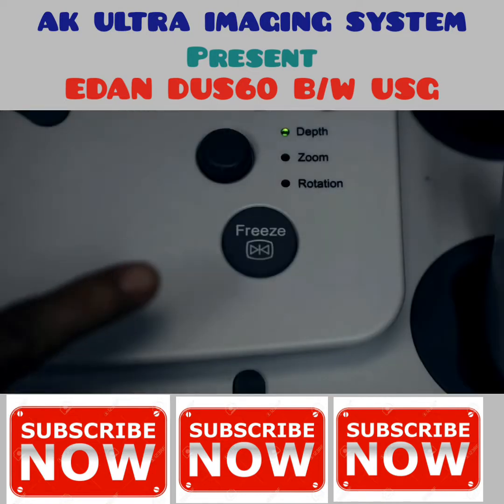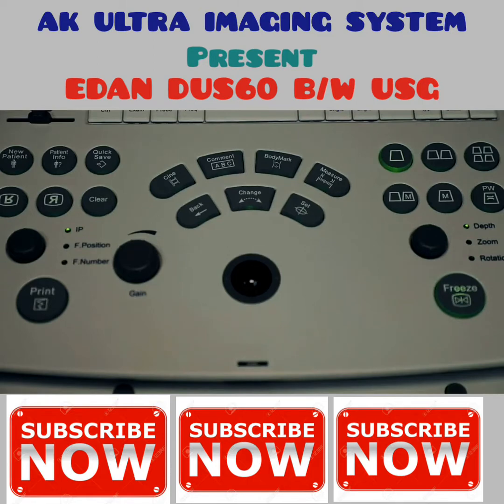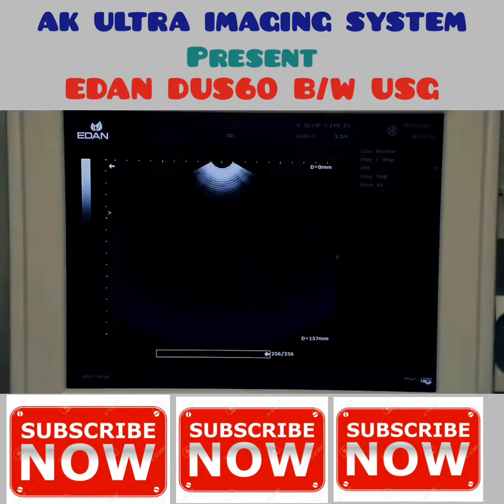To freeze an image, press the freeze key. To label an image, press the comment key, then use the trackball to move the cursor to the desired area, type, and press set to confirm.